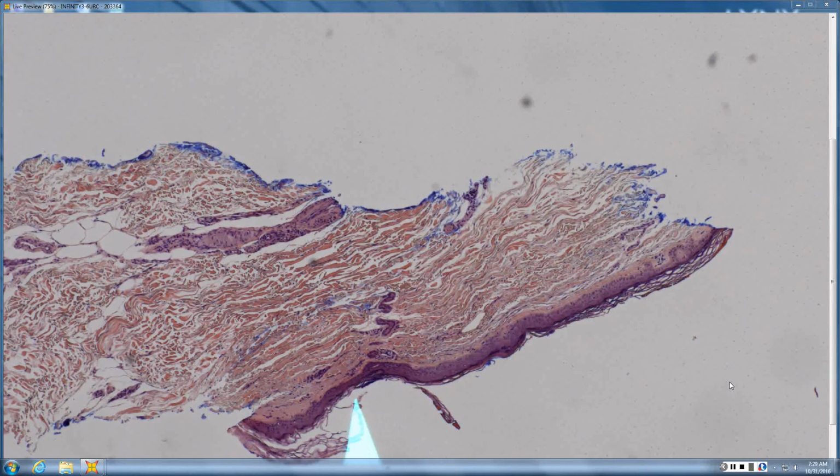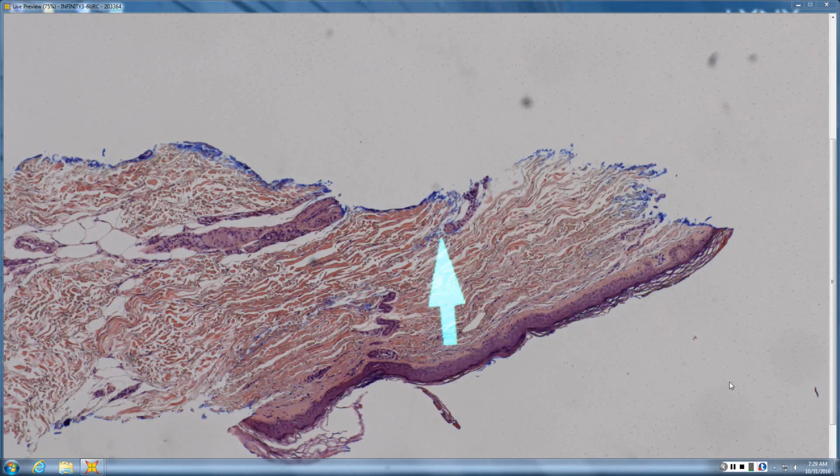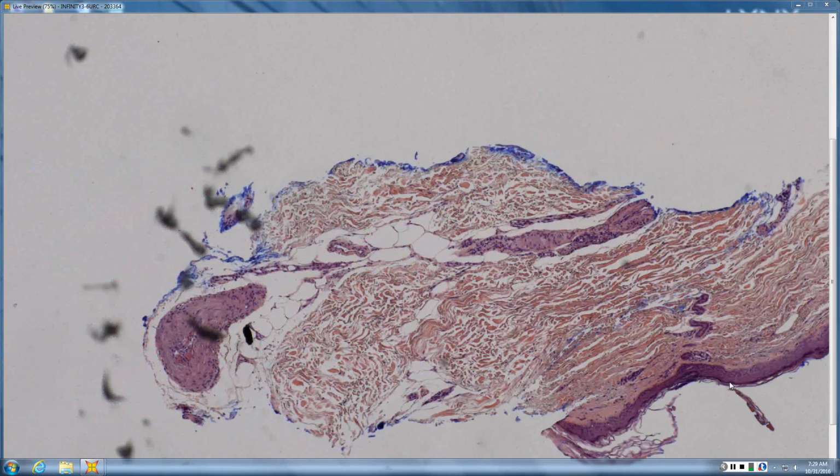Vasculitis, serum sickness tend to live there at post-capillary venule, which is, I think, what you thought I was pointing at. So, which is right where the reticular dermis meets papillary dermis. So that's post-capillary venule. Up a little higher in the papillary dermis are the capillaries, and that would be pigmenting purpuras, mainly, that live there. And then down here where you have arteriolar type vessels, what lives down there?